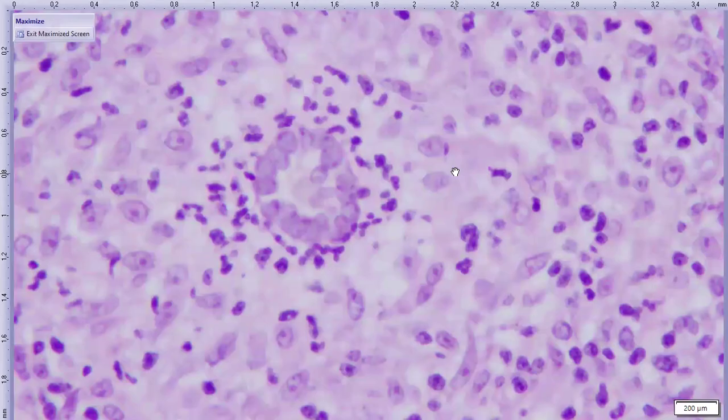And the nice thing is that they try to look at the morphology and weigh in on their PCR results and whether they make sense or not. Yeah, that's why they asked for the GMS to go with it. Exactly, hence the GMS. Pathognomonic morphology.